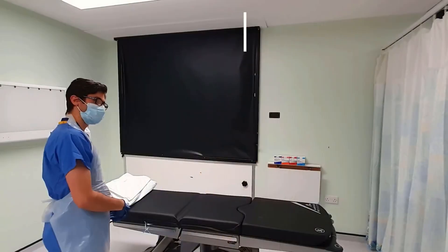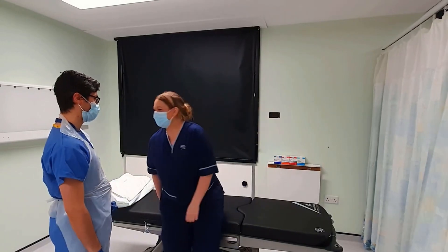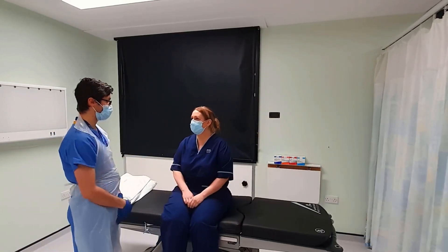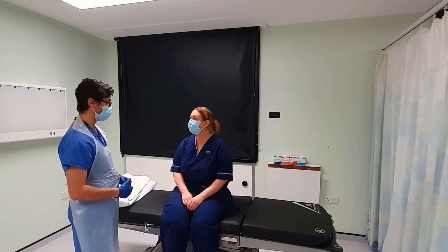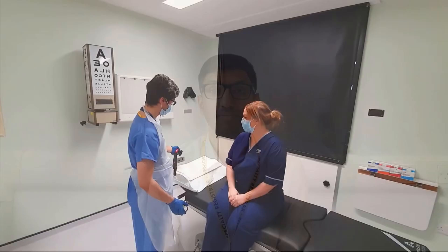Like with any patient examination, ensure you wash your hands and are wearing appropriate PPE. Explain to the patient that you'll be examining the back of the eye and that the bright light may be uncomfortable. Make sure that they're happy to proceed and answer any questions they may have. Dilate the patient's pupils to enable a full fundus view. Topical anaesthetic can also be used to ensure the patient is comfortable during the examination.